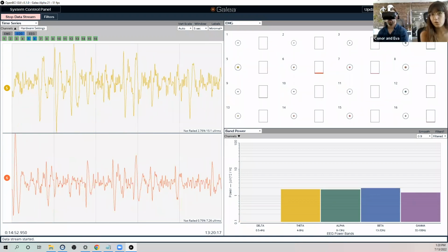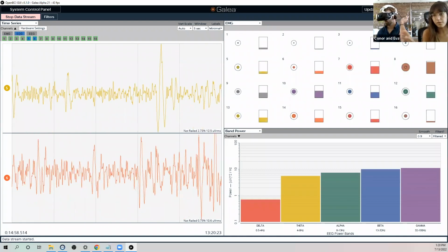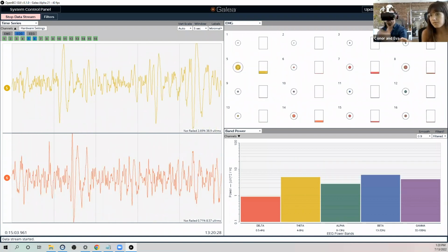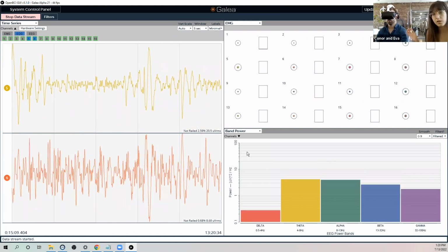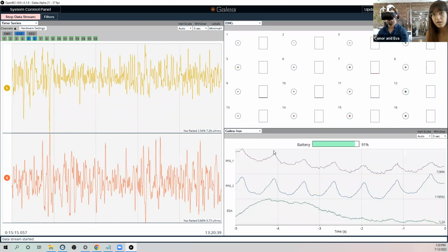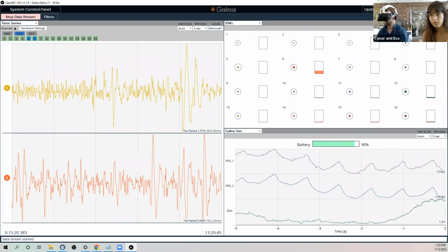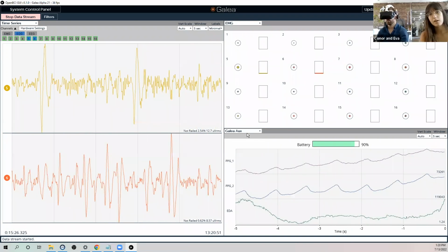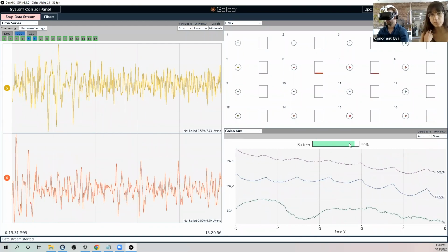Yeah, that's a good question. So currently the cables are plugged in only for the VR headset, and the device that Conor is wearing uses the Valve Index. And Galea has its own battery and it works with Wi-Fi. So it's connected to our computer via Wi-Fi and it sends the data wirelessly. Our beta units will be integrated with the Varjo Aero headset. Cool, thank you. And also, I forgot to mention earlier, in the auxiliary widget, you can check the battery of the device. So that'll be the battery of Galea itself.